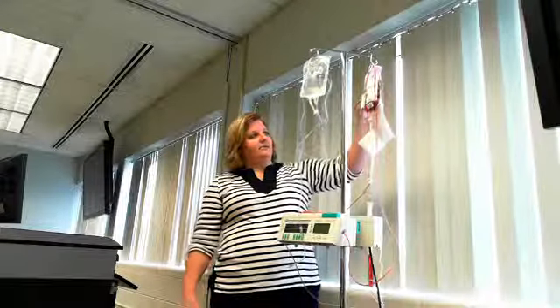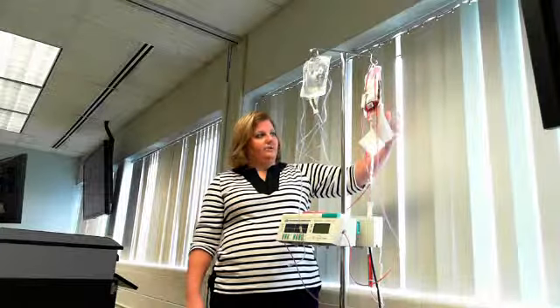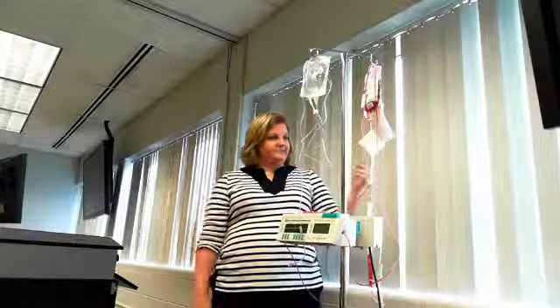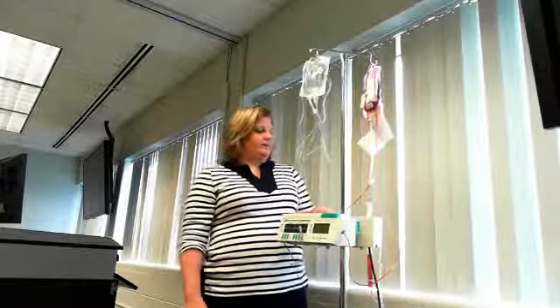Two RNs would go into the room: one would have the bag of blood with the label, and the other would have the vital signs record. Standing by the patient, you would verify them by asking their name and birth date, check their ID bracelet, and go through each item on the label — medical record number, blood type, expiration date, and time — comparing those to the verification sheet. The second RN would then sign the paper confirming the check.